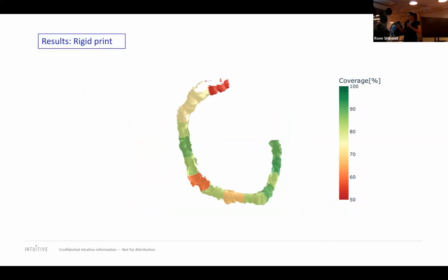So I already showed you this result. Unfortunately, we cannot get metrics on this because we don't know what is there in the place where you have a hole. We don't have ground truth for that. However, we can visually inspect the result.